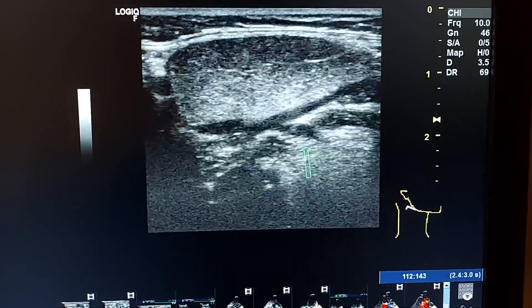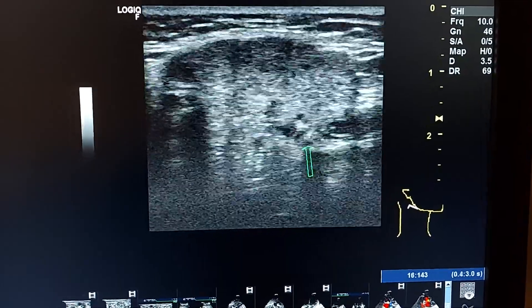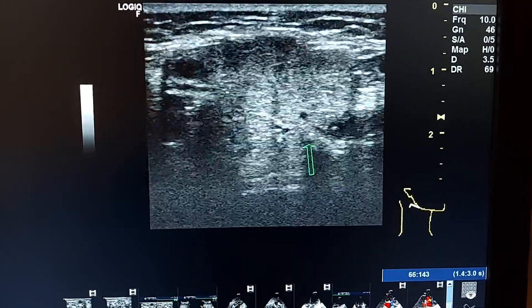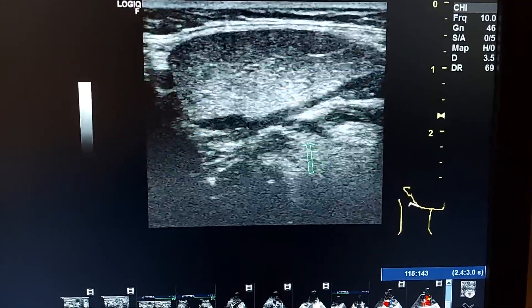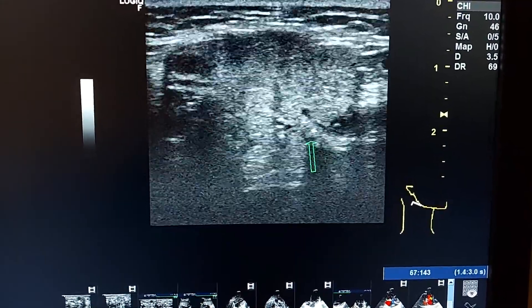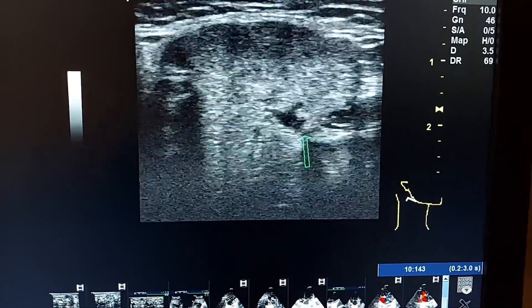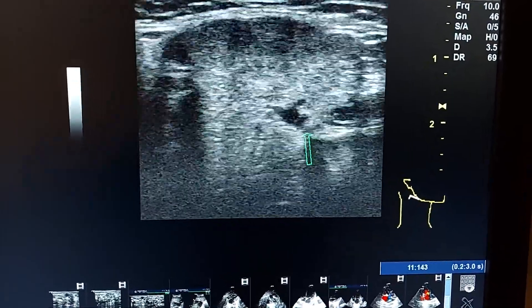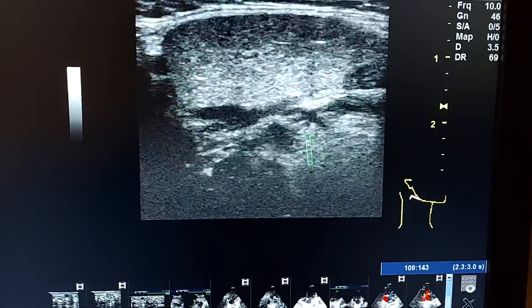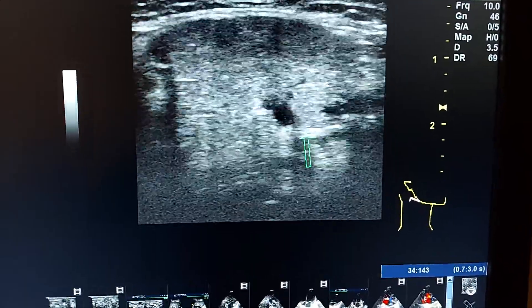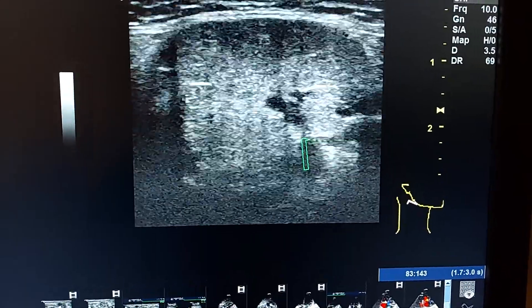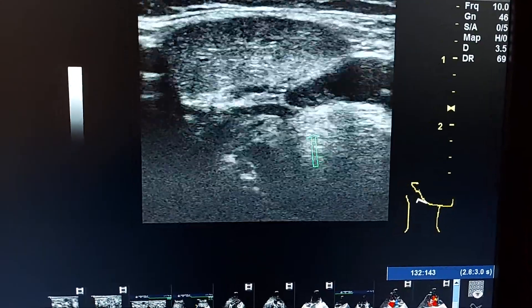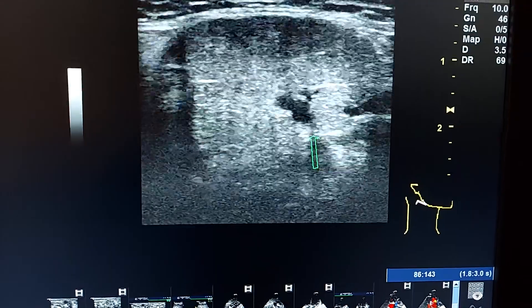This is an ultrasound case of a female, 19 years old, with history of swelling in the right submandibular region when eating.